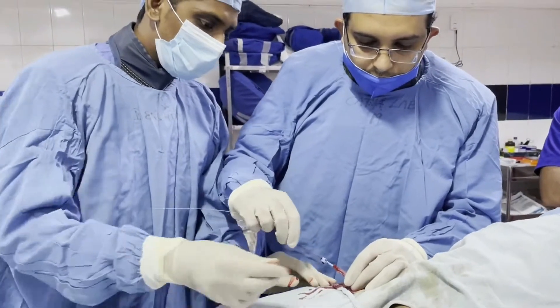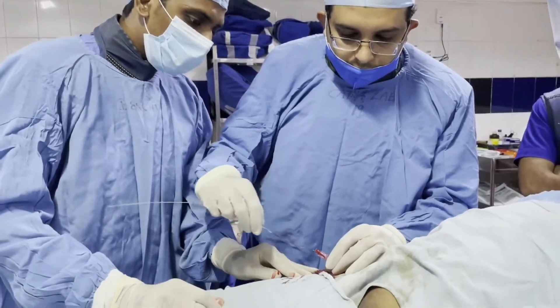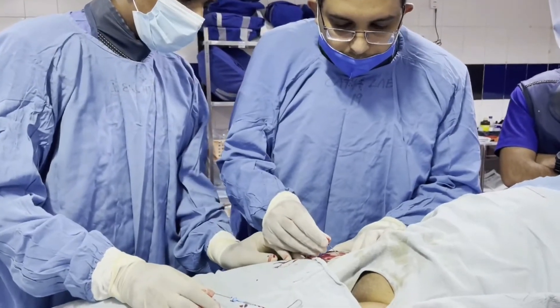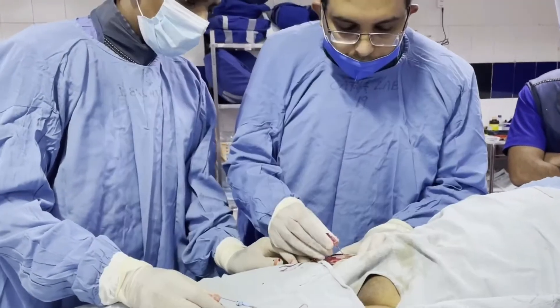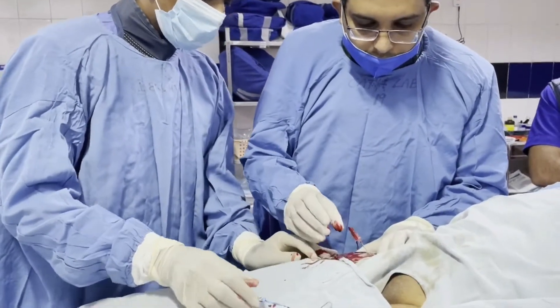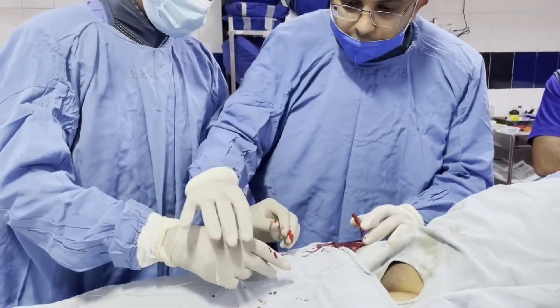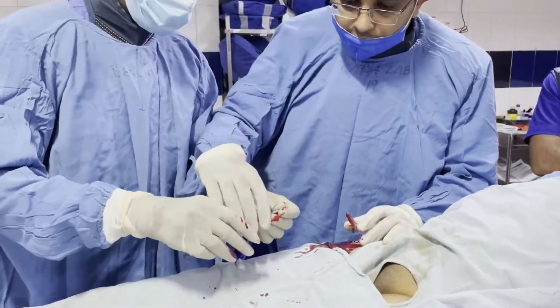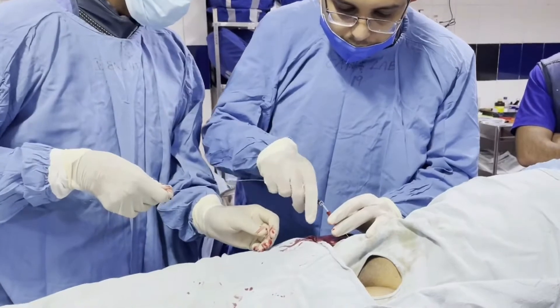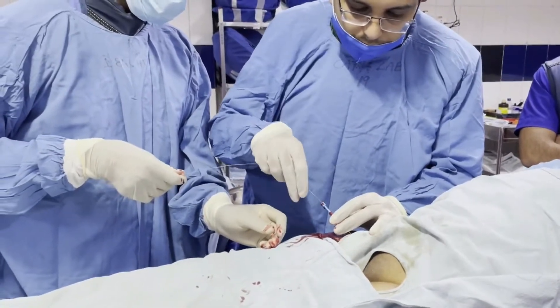If there is initial hesitation or difficulty, we need to check again whether the needle is correctly placed in the artery by readjusting it, or maybe completely removing the needle and reinserting it once again. Now after confirming the gush of blood, you insert the guide wire again.